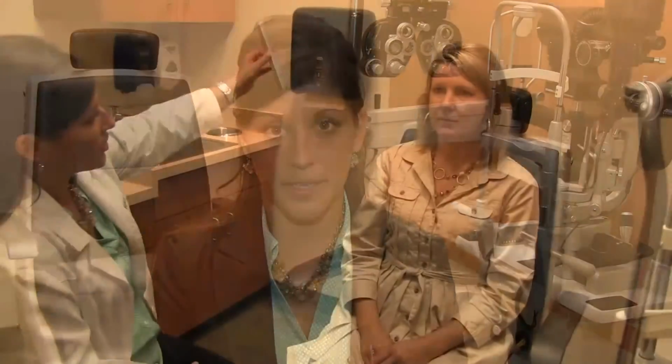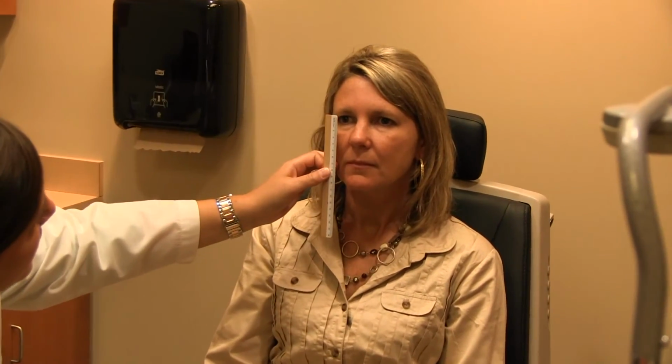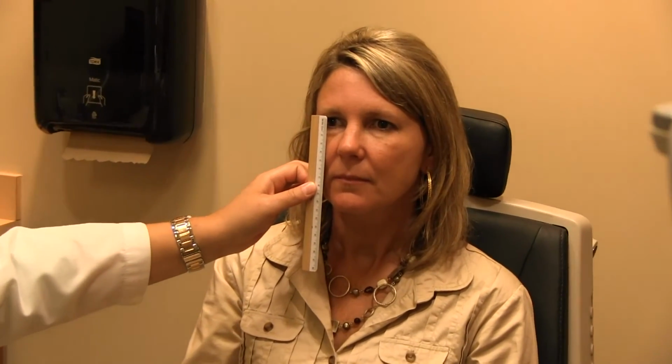When looking at lid position, one of the first things I measure is the palpebral fissure width, or the distance between the upper eyelid and the lower eyelid. Knowing this measurement helps in selecting lens overall diameter, and if the palpebral fissure is very small, I may order a smaller lens, or if it's very wide, I'll order a larger lens. The palpebral fissure width can also affect the overall lens stability and the lens centration.